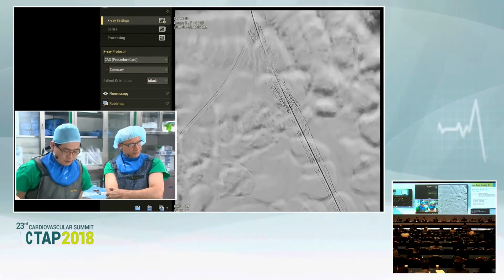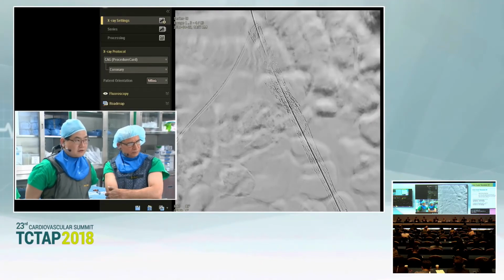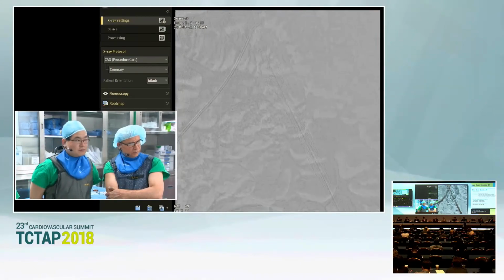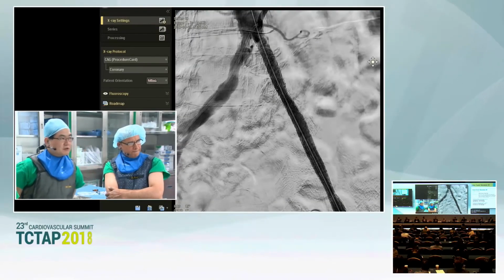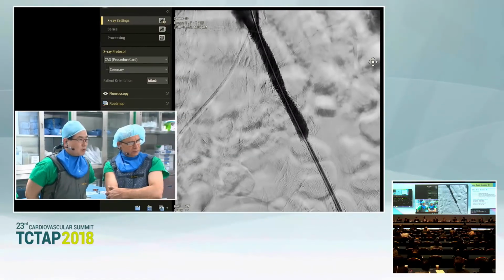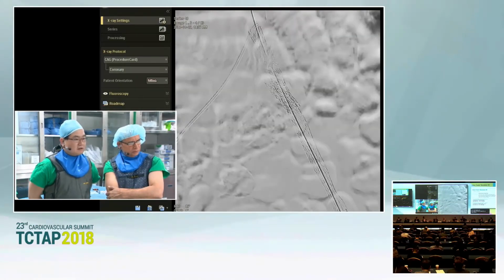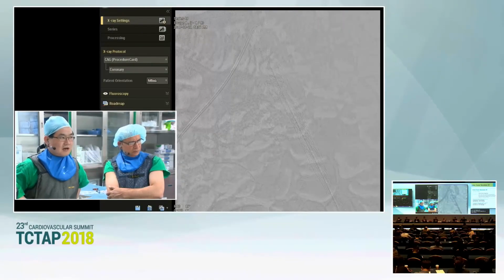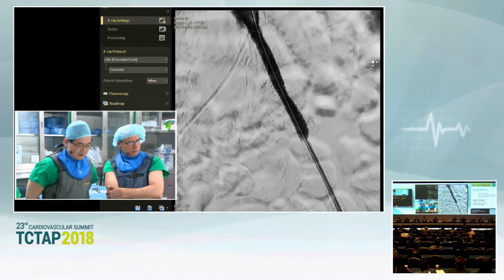You're quite correct. So initial IVUS showed that from the common iliac ostium to the proximal portion of the stent, the diameter was 9 by 8.3. So I think the nominal pressure of the Life Stream is sufficient for this patient. Another thing we considered is that there is some chance of thrombotic material in the proximal portion, so high pressure carries a chance of right or left side distal embolization. So I think high pressure was not primarily needed in these cases.